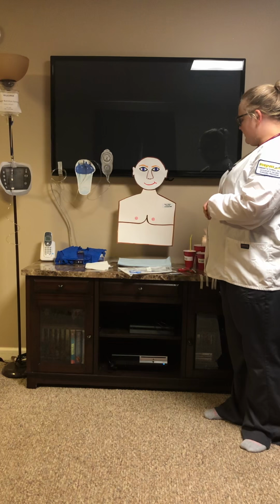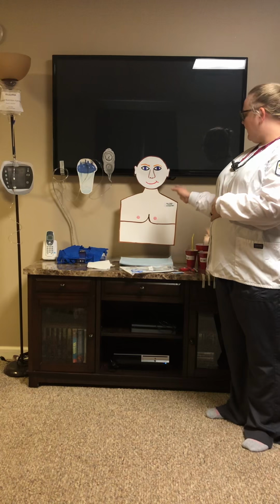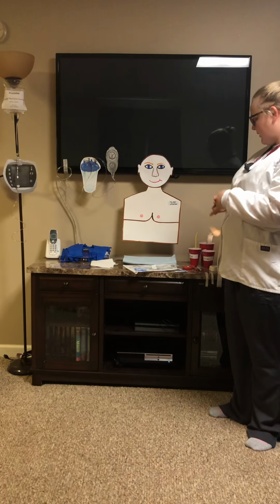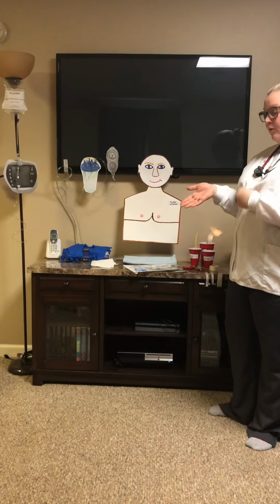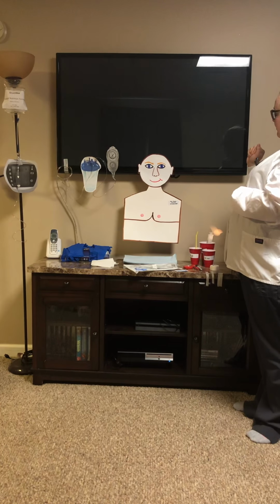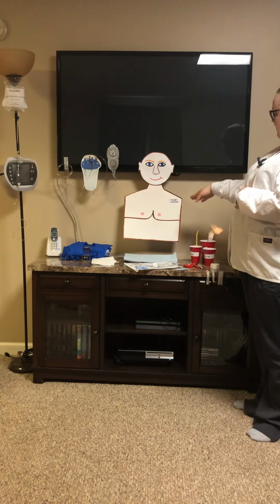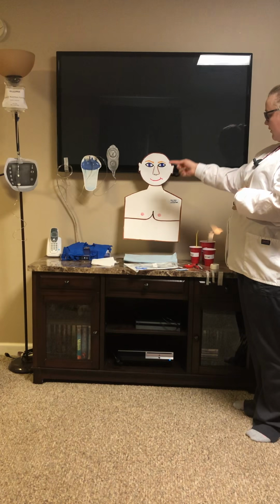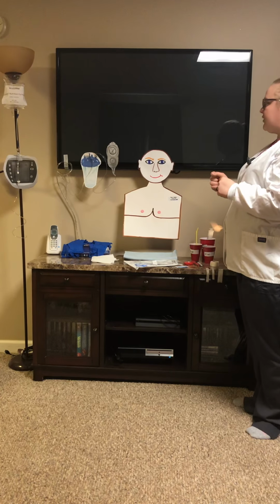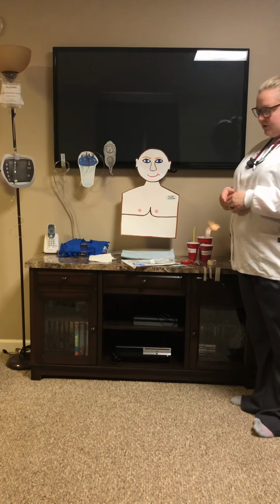place an NG tube in my patient and then apply the patient to suction via the NG tube. First, I'm going to verify my order. I have an order from the physician to place a NG tube on Mr. John Doe, which will require low wall intermittent suction. I am going to assess my patient's medical history.